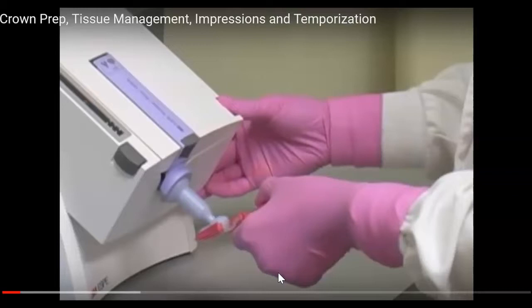Like I mentioned, this video is showing you in 2 different steps. So what he or she is loading into the tray is going to be used to create the impression.